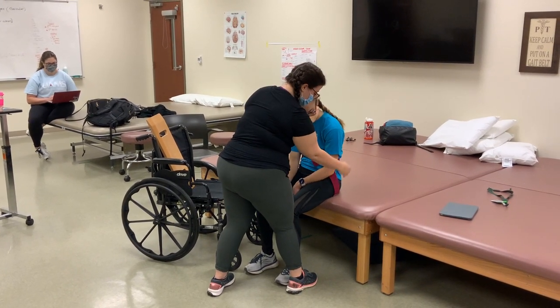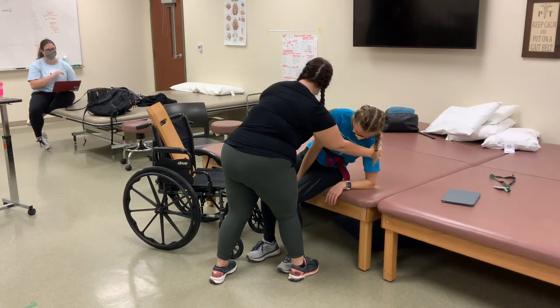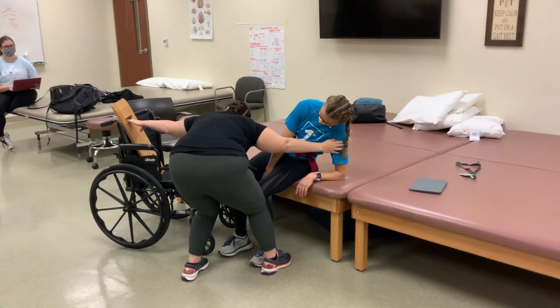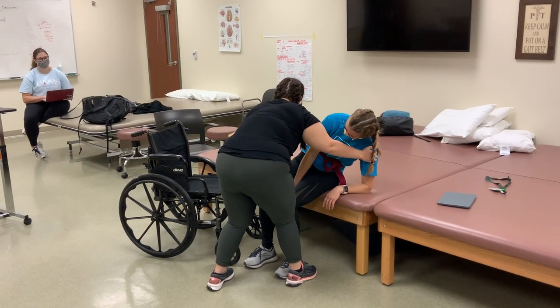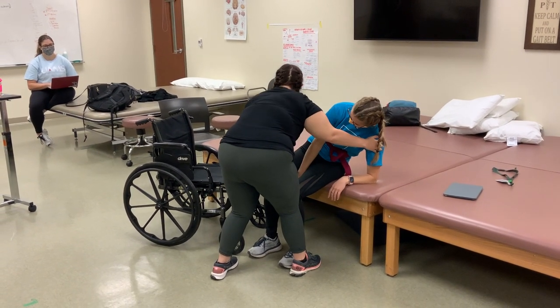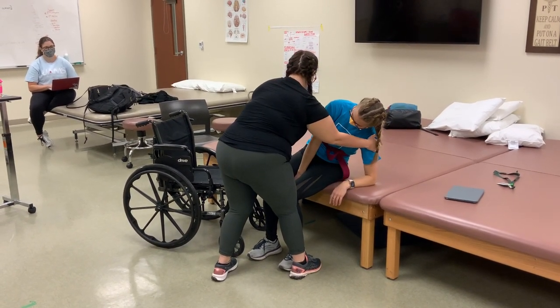First thing I want you to do — can you go on your elbow here? Good. Now slide this transfer board under your bottom. Okay, can you come up for me? Good.